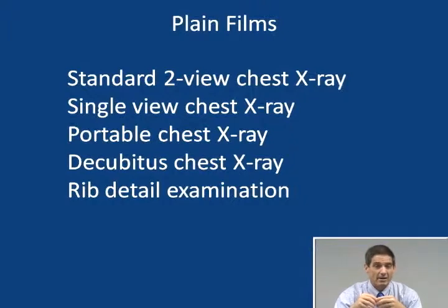They're going to magnify the cardiomediastinal silhouette. They're not going to be as good quality as an upright 2-view chest. Decubitus chest exam is done with the patient on one or the other side. Those were typically performed in the past to evaluate free-flowing fluid or small amounts of air and to see whether that would go to the dependent portion of the chest or not. Not very frequently performed anymore, frankly, because those have been supplanted by chest CT exams.